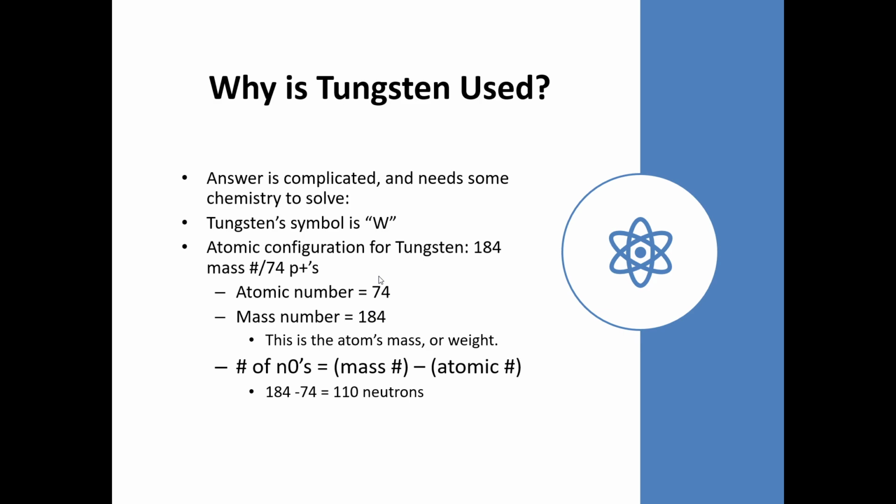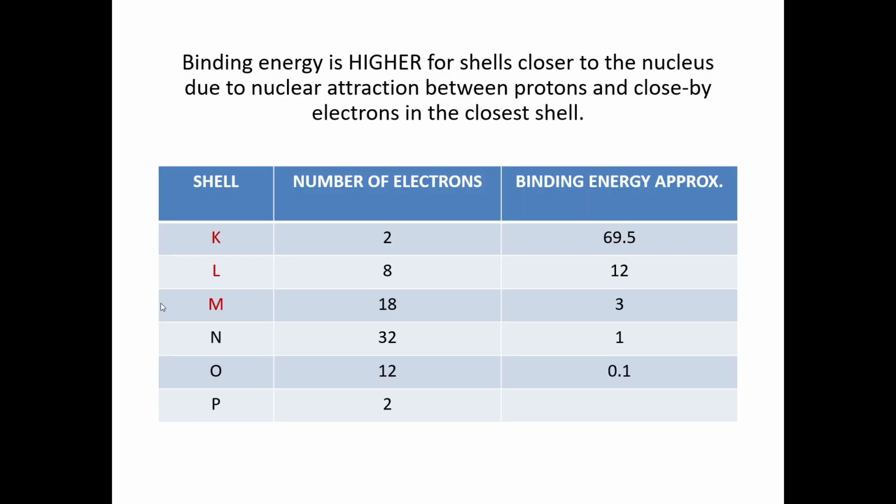And that kind of just goes along with the ability to withstand heat and its ability to take those electrons as they come across the gap from the cathode and stop them and turn them into X-ray. So another very important concept dealing with binding energies.